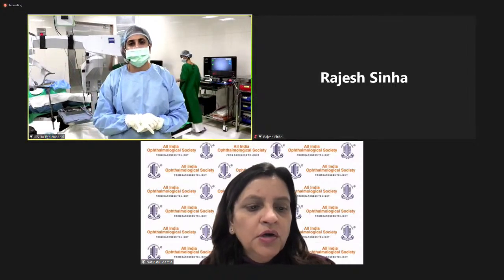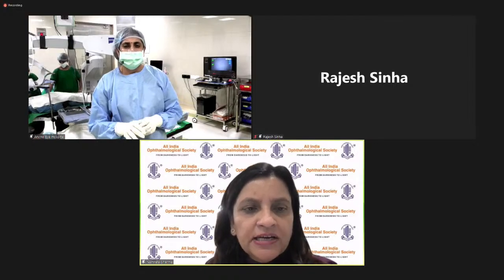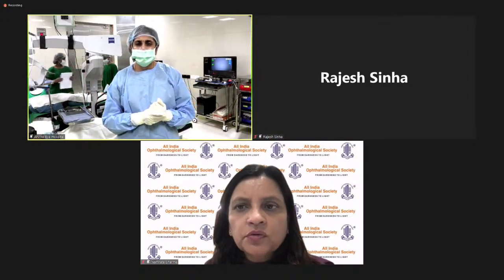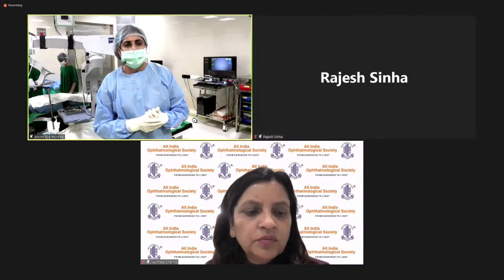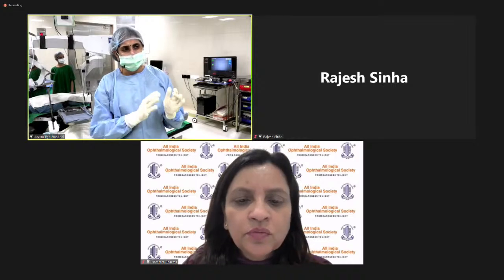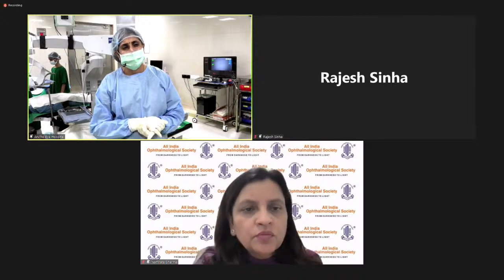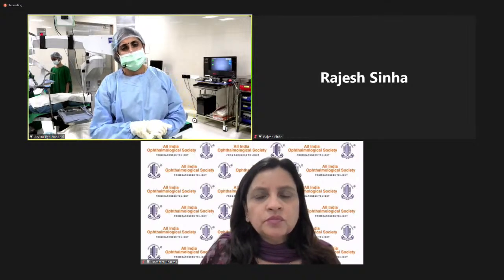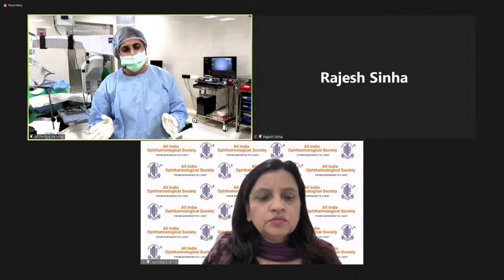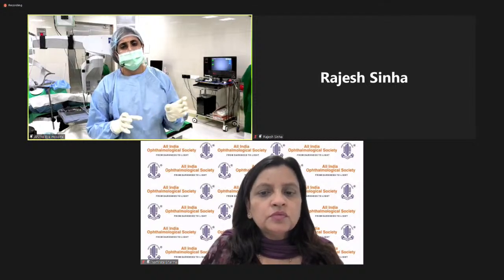I know that you've done a very large study comparing your Orolab toric, if I'm not mistaken, with other toric lenses. Can you tell us about that? So in that study, we compared the Orolab hydrophilic toric with the Alcon hydrophobic toric, and we found the rate of repositioning was similar with both lenses. In terms of absolute rotation, we probably have a little more rotation with the Orolab hydrophilic than the Alcon hydrophobic platform. But we don't reposition all the IOLs which had rotation, only if it is significant, like more than 15 degrees, or the patient has 1.25 diopters or more cylinder. And when we looked at repositioning rates, we found no difference between these two lenses.